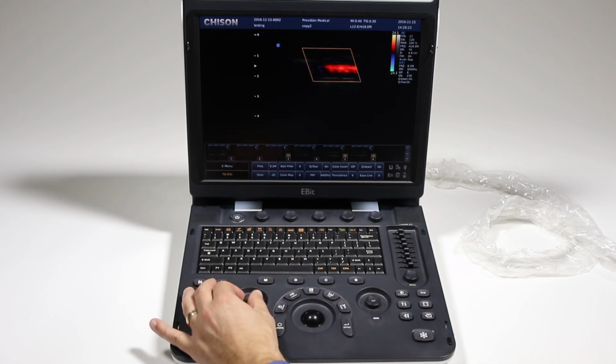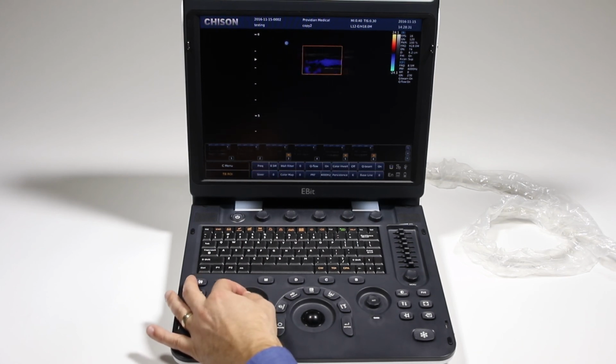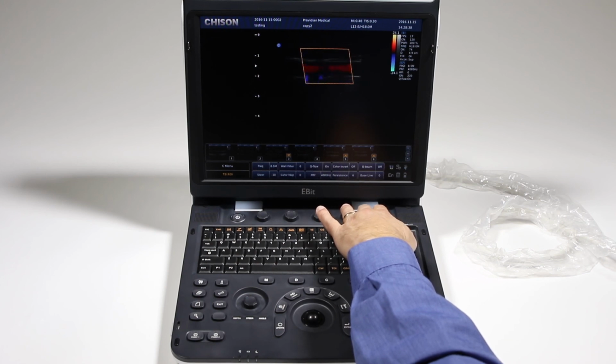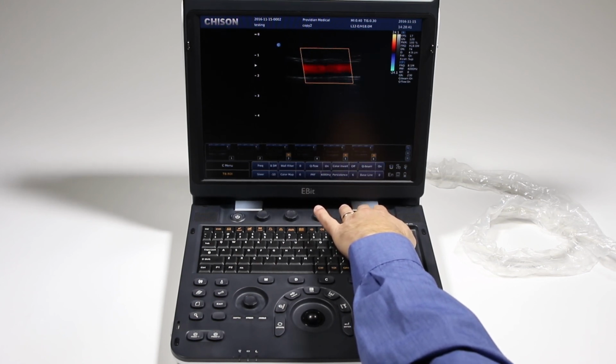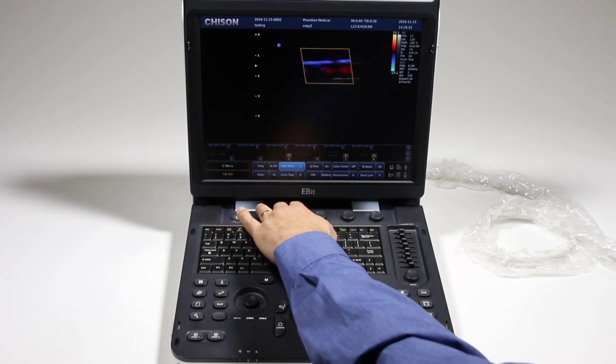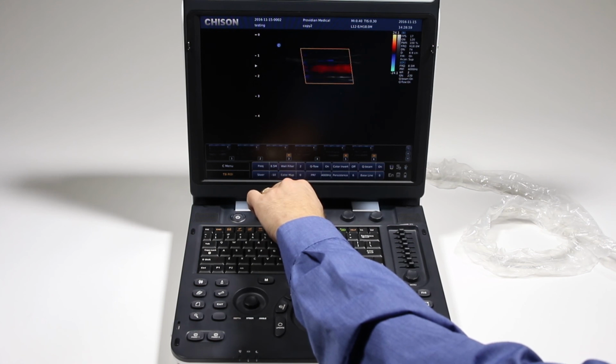Now same here where you can steer the box and push down, and we can change our depth again. So we can steer, depth, frequency. Q-beam is another way of helping clean up the image. You'll see there. It helps reduce some speckle in the image and clean it up a little bit. Down below, we'll also change our color map by twisting it here, and you'll see it change up top. If you don't like the way the colors are at default, you can change that.